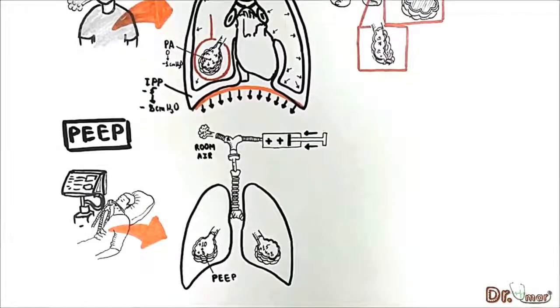This means now cycling begins at PEEP, in other words, the alveoli cycle at a larger size. Again, we will not allow the alveolar pressure to drop to zero because the sick alveoli collapse. It is very important to know expiration is not assisted but is accomplished in a normal manner due to passive recoil of the lungs, which pushes the air out and provides expiration.